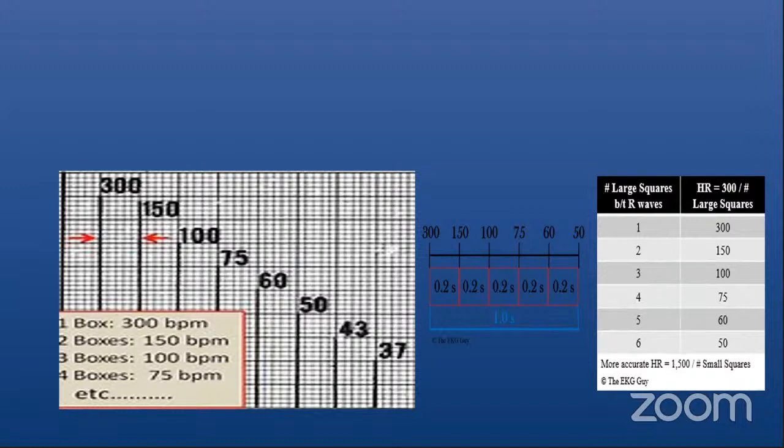Yeah. So in the rhythm lead, obviously, you need to know what's been happening during any resuscitation, if the child might have some sort of arrhythmias. That child, for example, is in SVT or in atrial flutter and in a decompensated state. So that's why the child was so collapsed. So when you're resuscitating, you don't know.